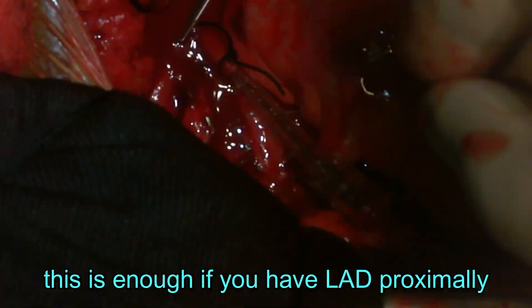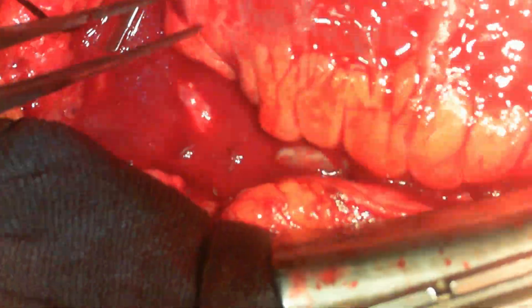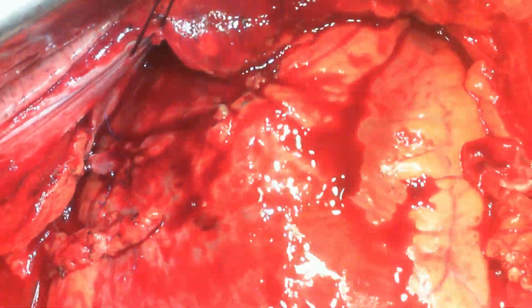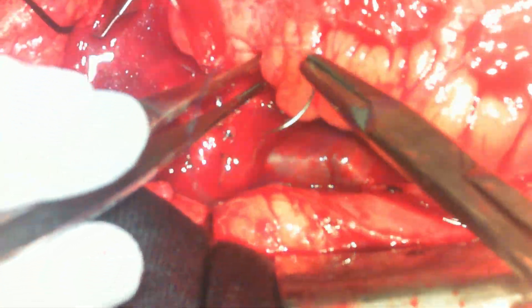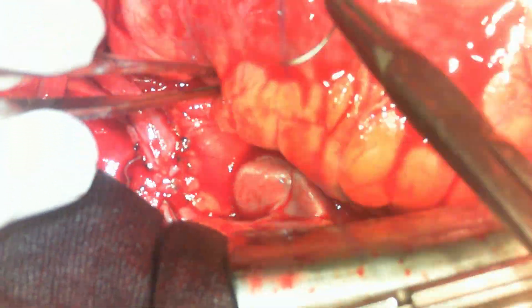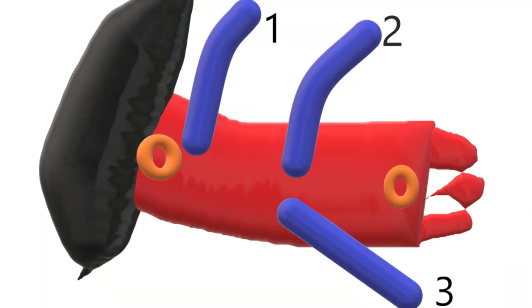To establish cardiopulmonary bypass, you need sufficient aorta for your aortic cannula, a place for your cardioplegia cannula, and a place to cross-clamp the aorta, so all aspects of the myocardium are perfused with cardioplegia. Due to poor planning, as seen here: graft one goes to the obtuse marginal of the LCx territory; graft two is an SVG to a very large diagonal; and graft three goes to the distal RCA or PDA.